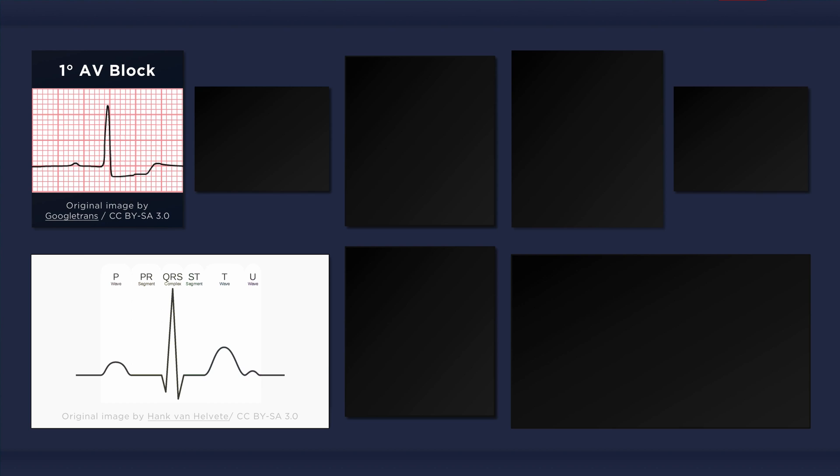The PR interval starts at the beginning of the P wave and ends at the onset of the QRS complex. Note that the PR interval includes the P wave and the PR segment. Do not confuse the PR interval with the PR segment, which is the isoelectric line that occurs in between the P wave and the QRS complex.